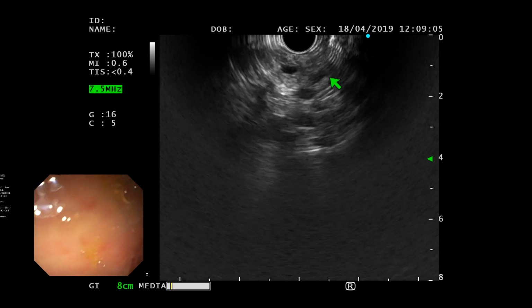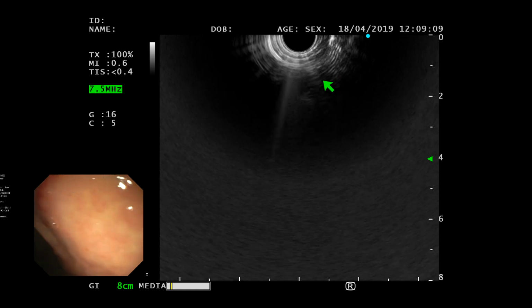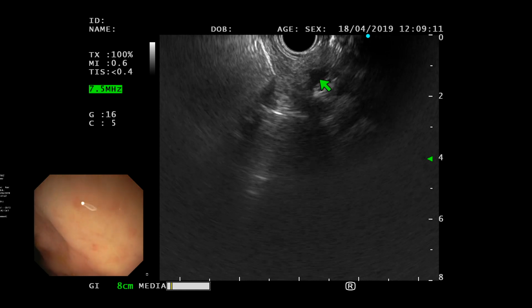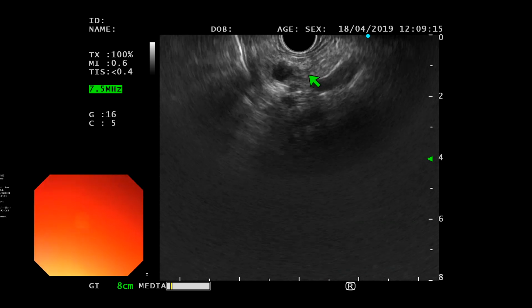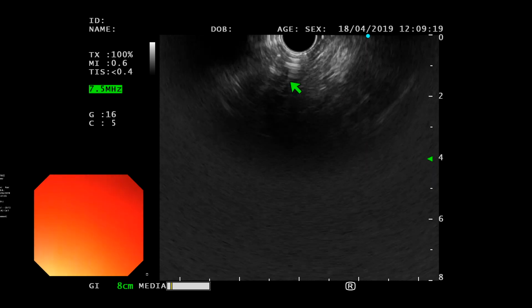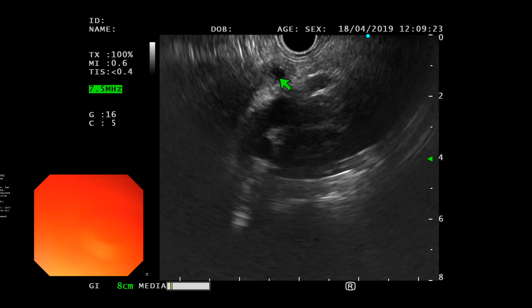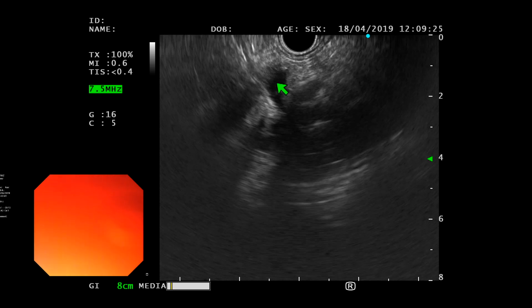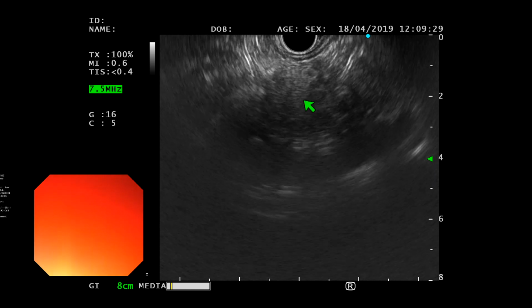Go counterclockwise. Okay. Now, one thing is when you start getting air, you see what's going on. There's air there. Two things, yeah. So suction, and then big wheel, exactly. There you go. And now you see what you did. So go back the other way. Do the opposite. There's the pancreatic duct. Yeah. There, as you go counter, away from you, you see it coming down. It is dipping down. Exactly, dipping down, right?